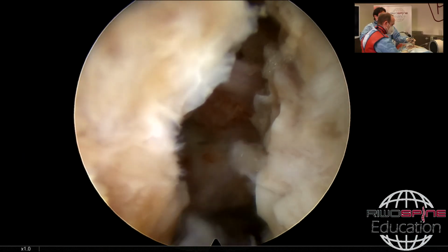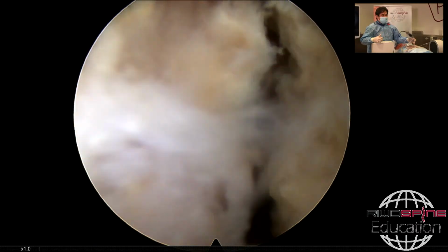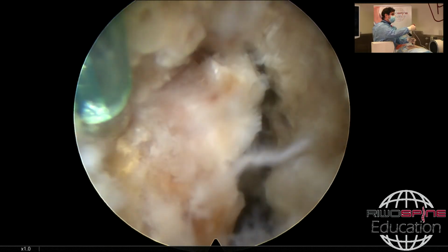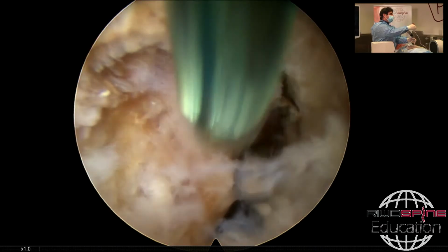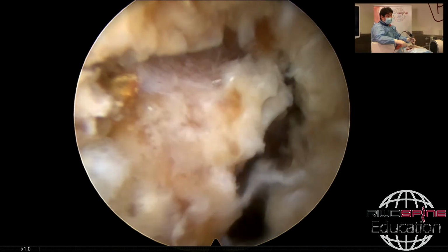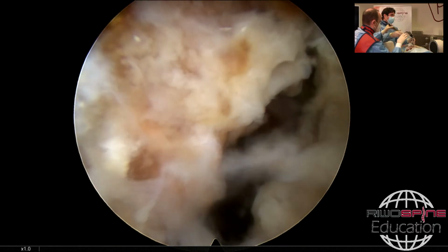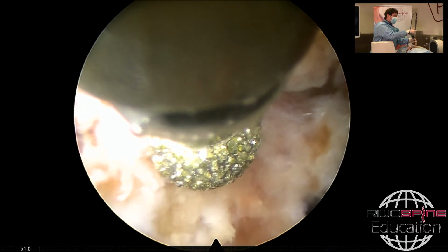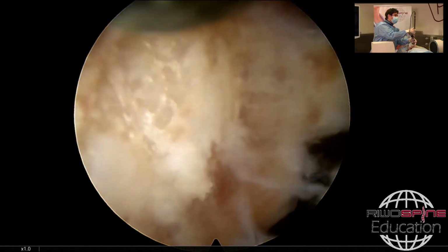Okay, again, if it is located more caudally, then we can increase our resection to the caudal side. We can resect from the caudal lamina like this. You see the upper edge of the caudal lamina here. But what we prefer to do is that before opening the flavum. Can I have this one? Then I would prefer to resect the posterior part of the lamina first, like that, with the diamond 4 millimeter burr.